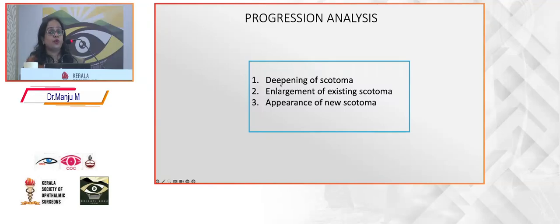Now coming to the progression analysis. So what is basically progression? There can be a deepening of scotoma, enlargement of the existing scotomas, and appearance of newer scotomas.